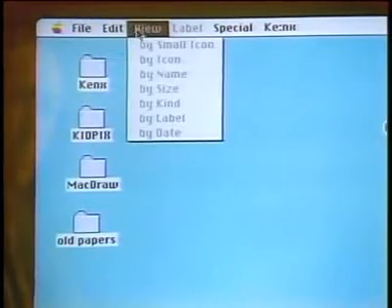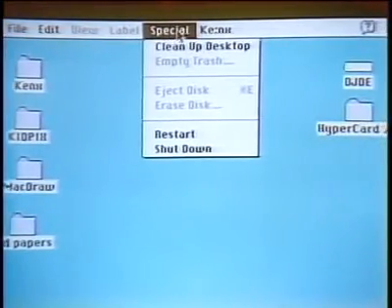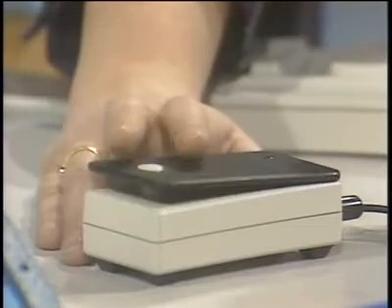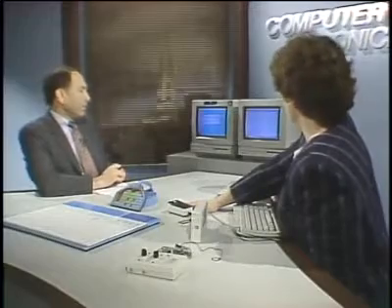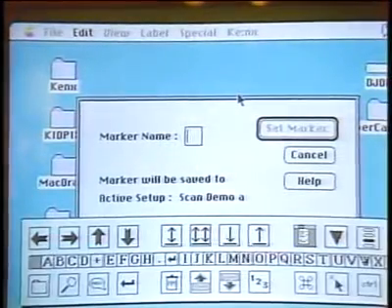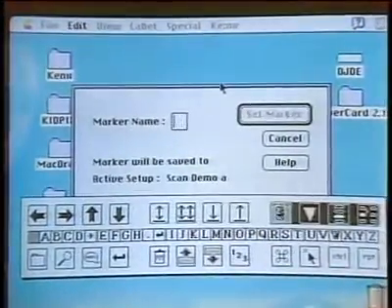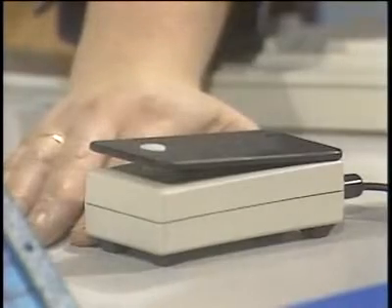Now I use my switch to make my selection. The pointer goes up, pulls down my menus, and begins to automatically move to the right. So let's explain what's happening here. What's happening is we're scanning all the possible choices simply by clicking that button. That's correct. And then clicking when you get to the choice that you want to use. Exactly. How we handle dialog boxes is that we know there are buttons in the dialog box, so I'm able to choose an icon that will scan all the buttons in my dialog box.